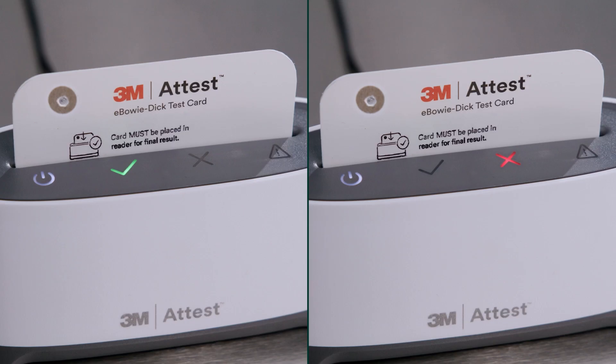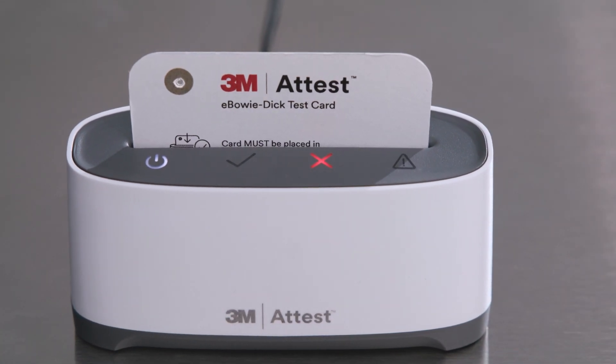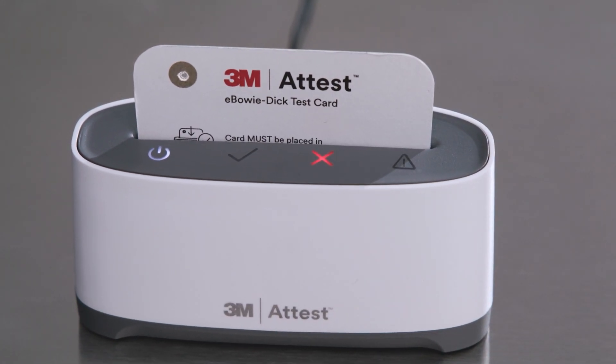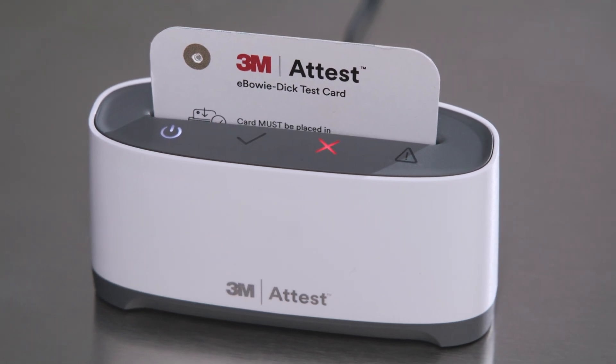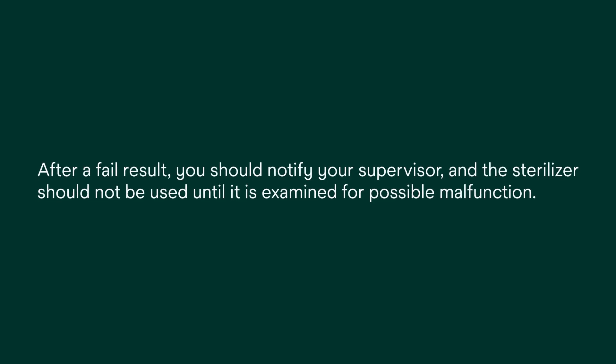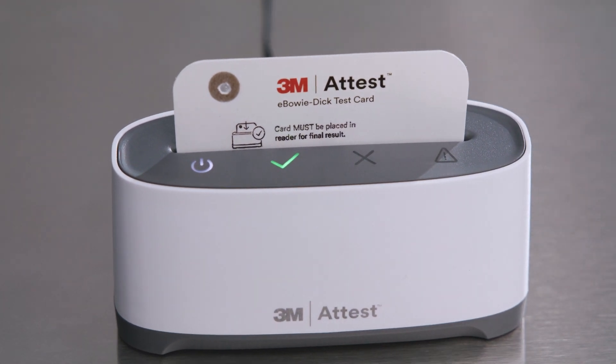At the end of the 5 seconds, you should see a green check or red X on the top of the reader. A red X result for a processed test card indicates a failure in the sterilization process. If this occurs, you will hear an alarm depending on your setting. After a fail result, you should notify your supervisor and the sterilizer should not be used until it is examined for possible malfunction.